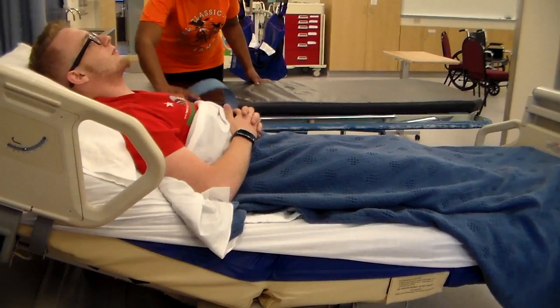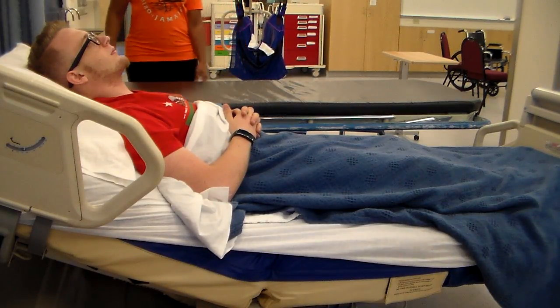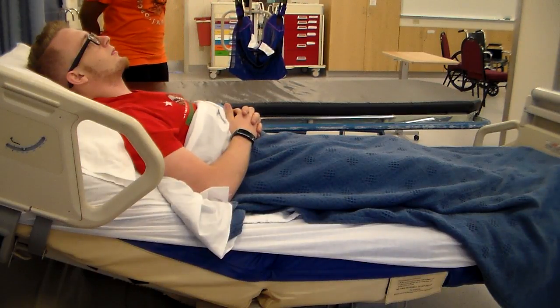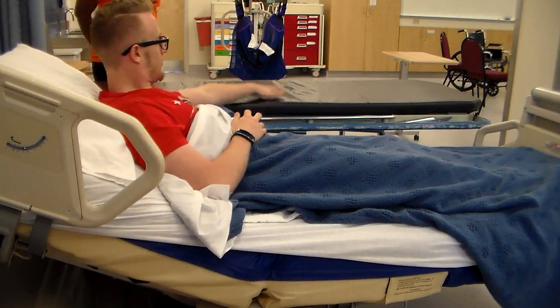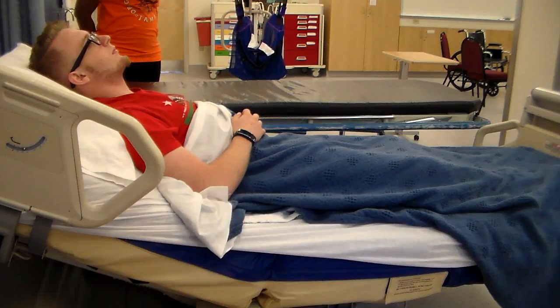I'm going to pause it. All right, so we're still working on the same skill. This is going to be transferring between a bed and a stretcher. As you can see, we've brought the stretcher in. It's that black flat line that you see in it. There you go. Okay, so we're going to be moving on to the stretcher.